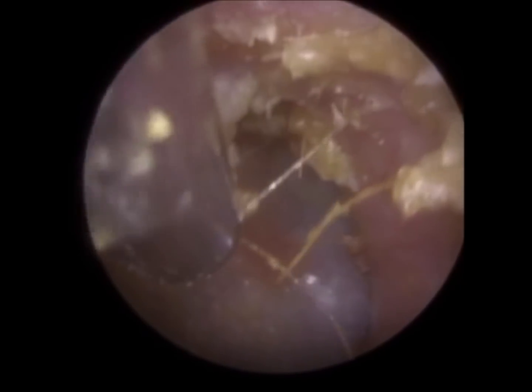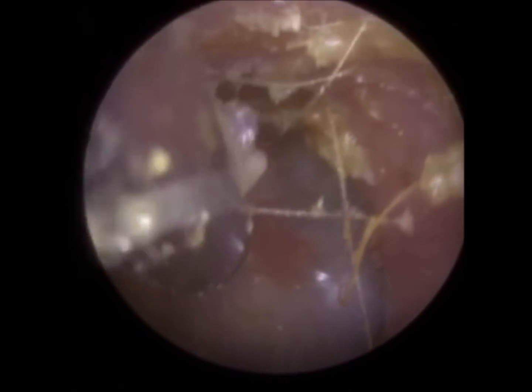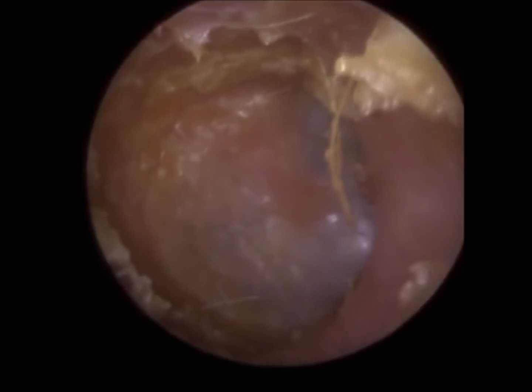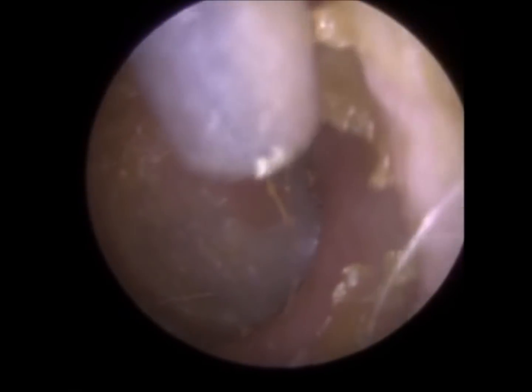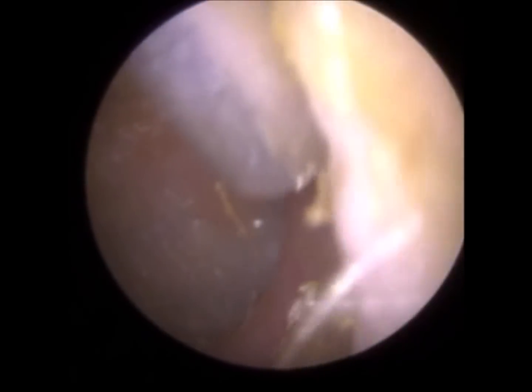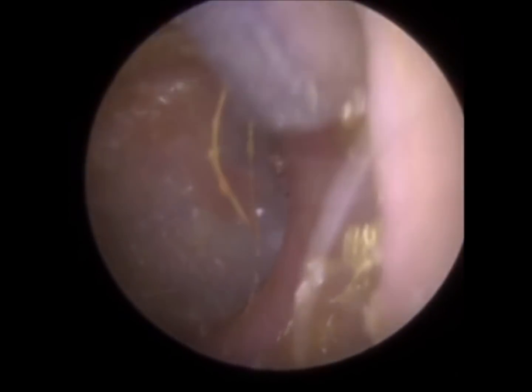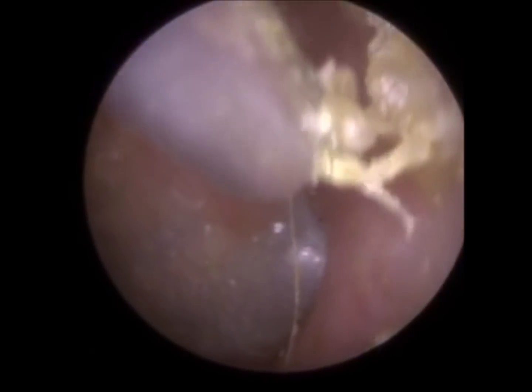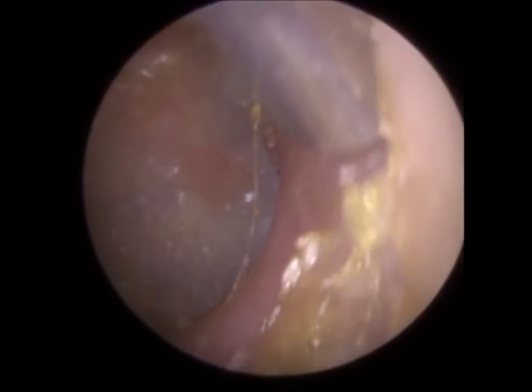See, I've got the majority of the blockage there now. It's going to be virtually impossible for me to remove every little speck of dead skin and wax from this ear. It's just too mushy. It's almost like a soft poo, soft stool kind of consistency. So it's all merged and stuck and adhered to the canal wall. But I'm just using a fine end gauge now just to mop up as much as I can.